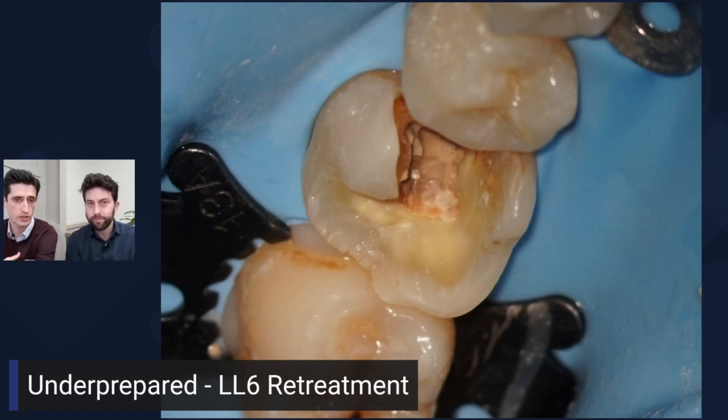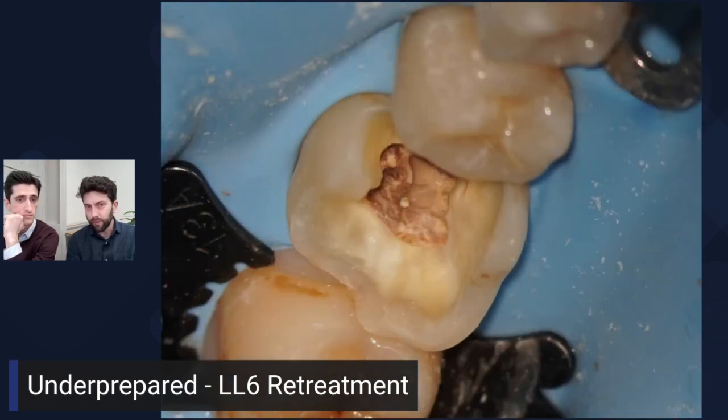We go on about restoration out, cusps down. I strip out the old filling first using a standard flat-end cylinder bur. Then I set about removing caries from the periphery, clearing as much peripheral caries as possible. We can see caries under the mesial buccal cusp — that's going to fracture if left as is — so we reduce that mesial buccal cusp by a couple of millimetres. This gives a shorter tooth that's less likely to break, and we can see the paste root filling in the middle and start thinking about removing it.